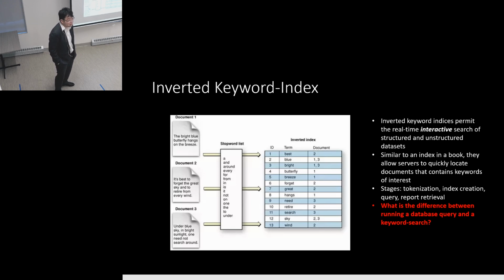Right, so there were a lot of radiology departments that could not search their reports. Now there are many more. I would say there are commercial products that some departments have chosen to purchase. I know at St. Michael's in Toronto, downtown UHN, and that kind of thing, they have certain things as well.